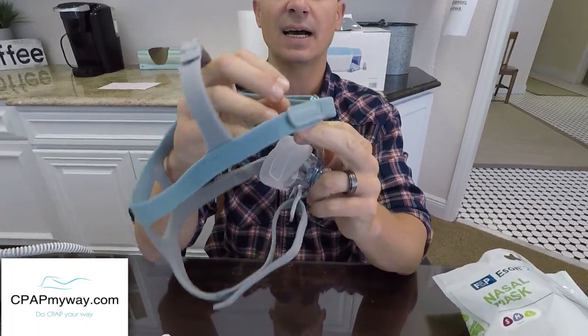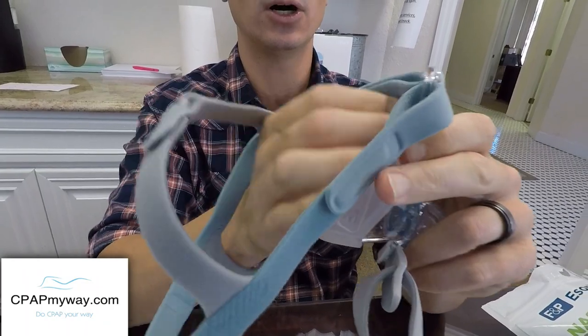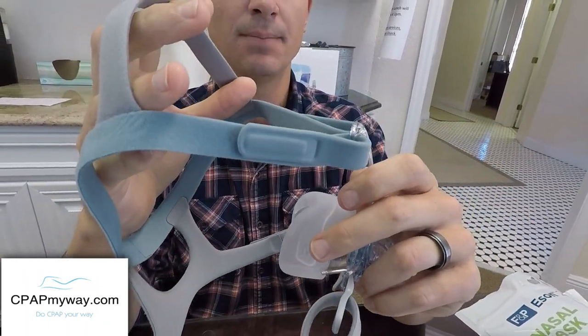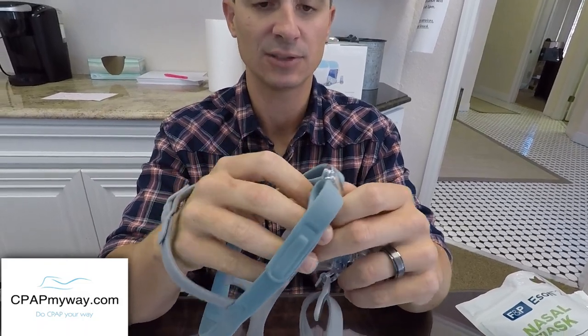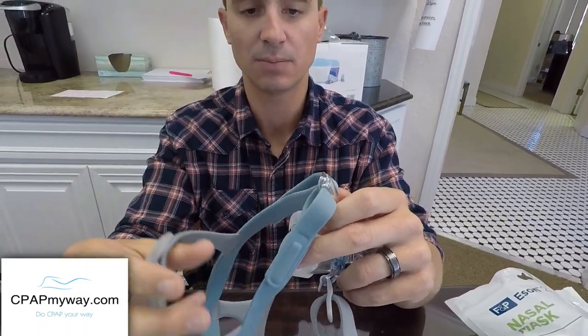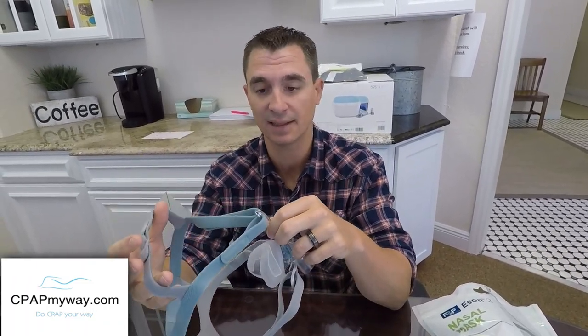The other downside, I skipped around there, is that it's a little bit of a funky forehead piece. Some of the older styles had a pad up here. This one's designed to maybe not even touch your forehead at all, which you'll see on my head. But it's a little funky to me on that. I don't know why. It just feels weird not to have something pressed and secured against your forehead. But it does a great job sealing, so I really can't take anything away from it.